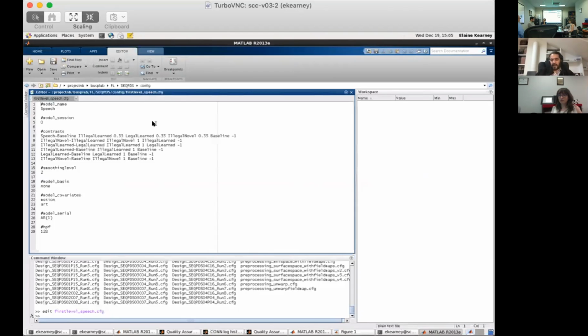Basically, you have a P-mod field. I don't know if you recall, in the configuration files where you enter the information for each individual run, you can also enter this P-mod, which corresponds to these parametric modulators, which is yet another type of covariation that you can have. In this case, it's basically one number per trial for whatever you're modeling as individual trials, which might be a whole block, or it might be an actual trial, like in an event-related design.